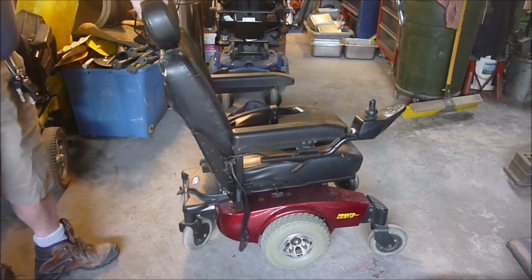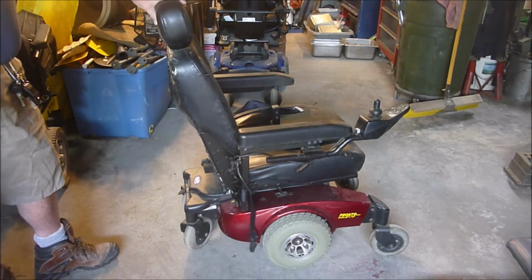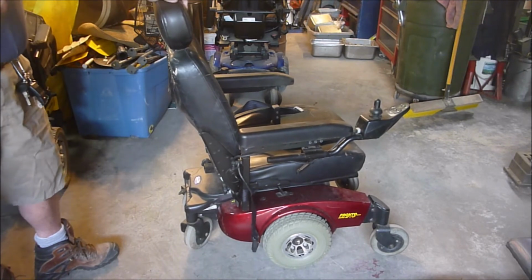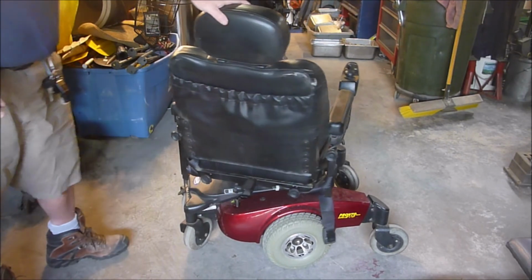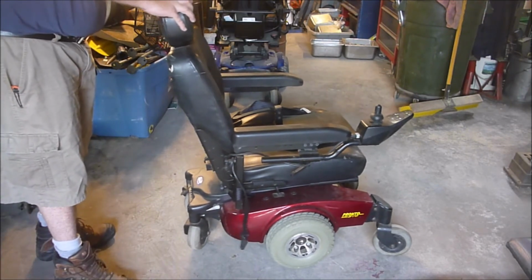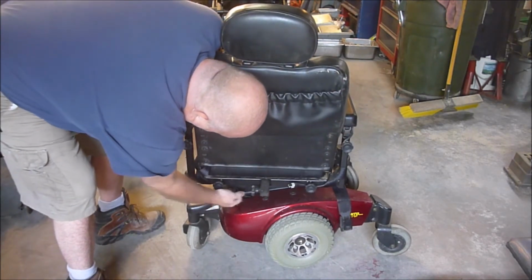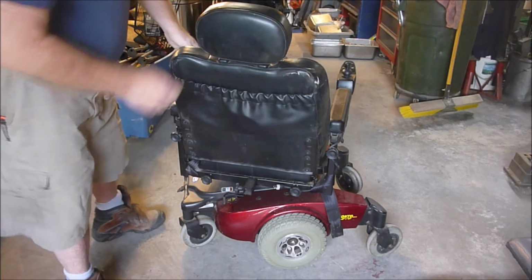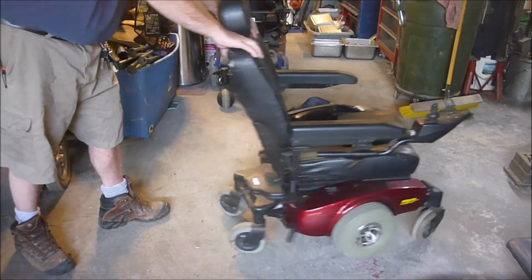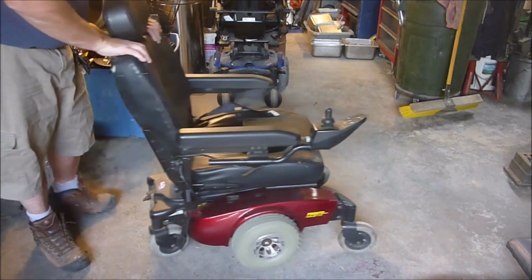If you're like me and you're willing to take a chance, and I don't know anything about this one, but if you want to at least see if the motors are probably going to work, this is not a guarantee, if it won't push, that means the motors are engaged. They all have these right here somewhere on them, and there's another one on this side. Oh, definitely needs some work. It's a little bit solid, but now I can roll this thing around wherever I want.